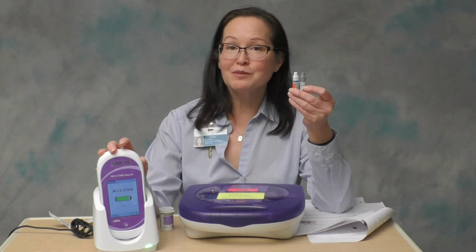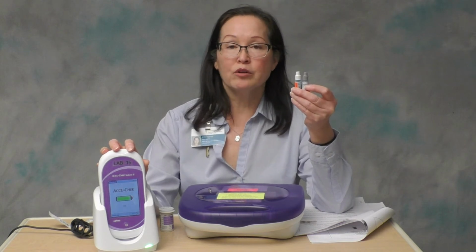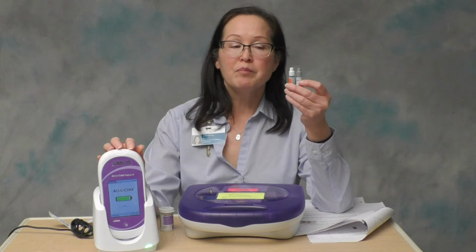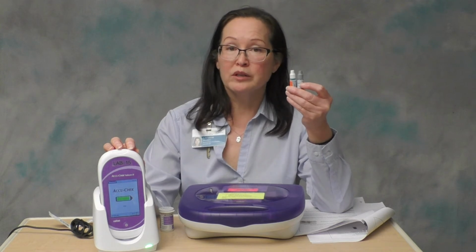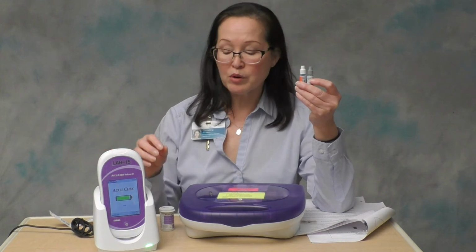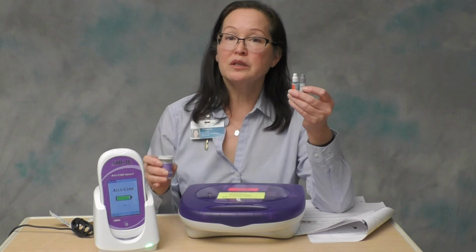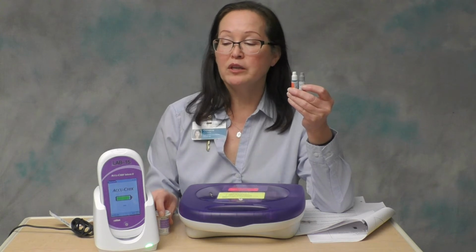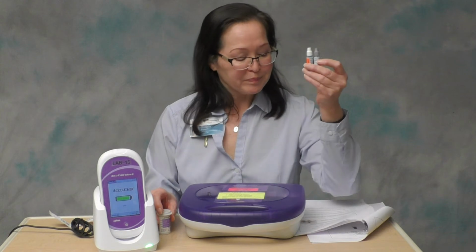It's everyone's responsibility to run QC. On some of the nursing units, it's a part of the workflow to have the HUC run daily QC on the instruments, but all nursing staff needs to know it's also your responsibility to run QC. If the meter hasn't had QC run on it in over 24 hours, or if you open a new vial of test strips, it's your responsibility to run the appropriate QC before you perform patient testing. That way you can have a high degree of confidence that your test results are accurate.